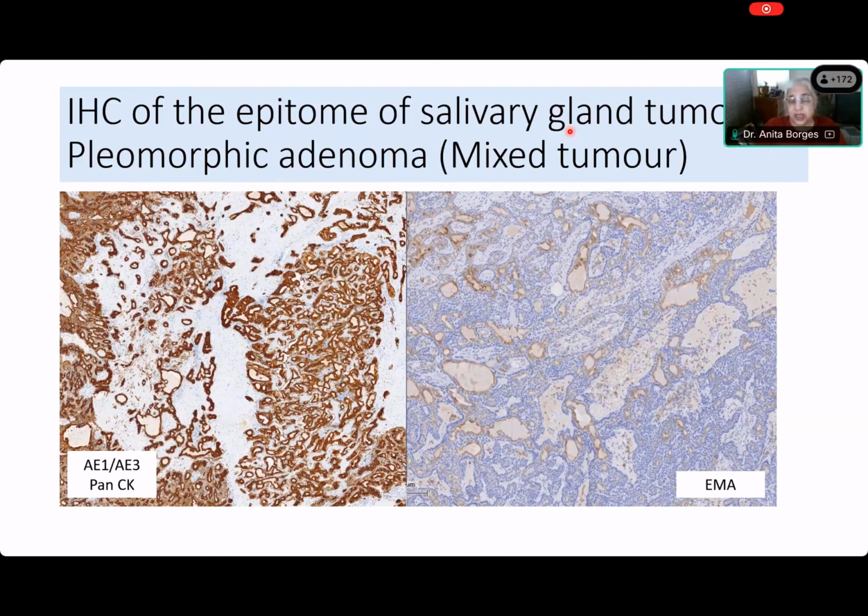You see this myxoid material that is being laid down by the myoepithelial cells, and they are wrapping themselves around, and you get this cribriform pattern. Akshara is absolutely right. So what you're seeing here is an adenoid pattern. You've got true tubules and an adenoid pattern, because these are the two patterns that the myoepithelial cells produce. So this is a classical cribriform pattern or an adenoid cystic pattern.